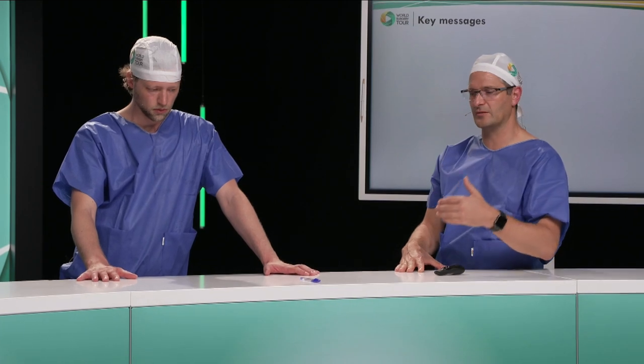But it has been described that dislocation of membranes is a known problem. Now imagine you make it even more unstable because you have some minced tissue below. So, I mean, I leave it up to the judgment of each surgeon. But for me, certain defects require fixation of the device, of the membrane, to the defect. And you think we really need the fibrin glue? When I fix it with sutures, no. Yes. But now we have glue.